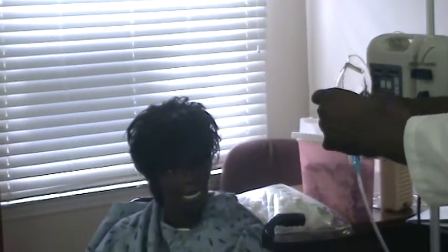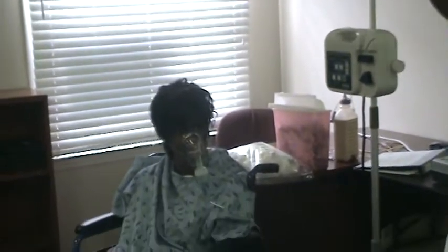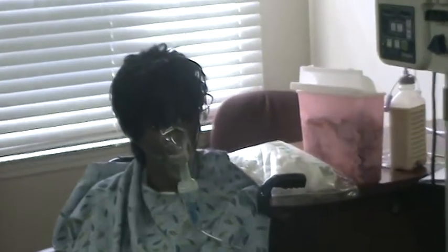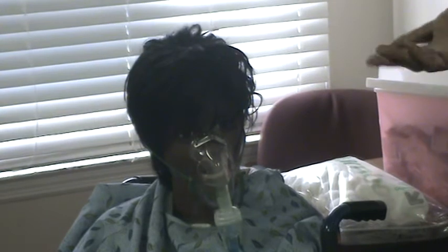Miss Susie, I'm going to give you a breathing treatment. Or you can say nebulizer treatment. Turn the machine on. It will just blow the air into a mist, medicine, and then she'll be inhaling it, and it will loosen up her chest, lungs, and allow her to breathe better.